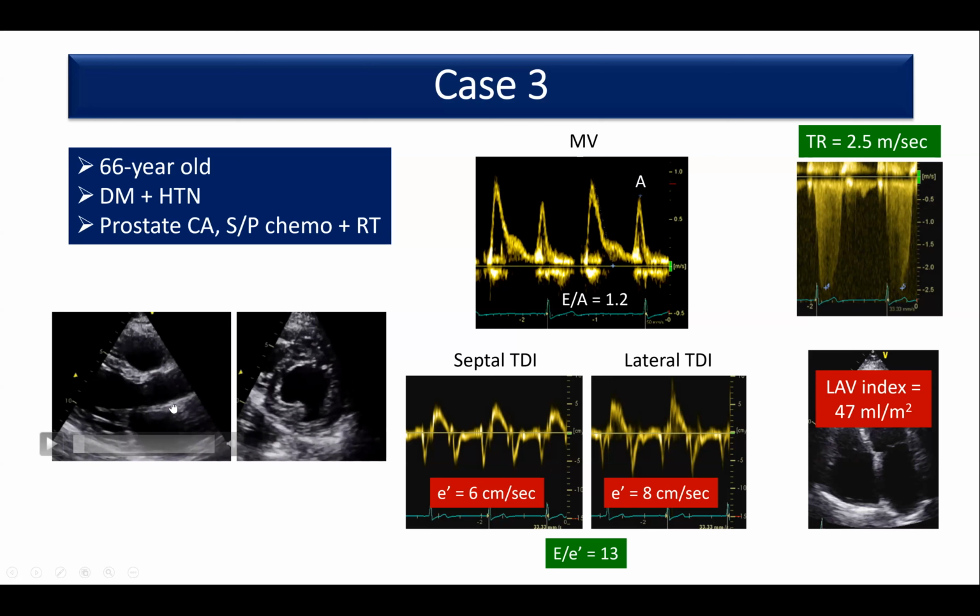Because systolic function does not equate to ejection fraction. They're not the same. You can have a normal ejection fraction, but if your patient has abnormal strain or abnormal S prime or abnormal MAPSE, that patient would have a normal ejection fraction but abnormal systolic function. So remember, ejection fraction does not imply systolic function. There are other parameters to assess systolic function, including strain, including GLS, including MAPSE, and including S prime velocity. So this patient has normal ejection fraction.